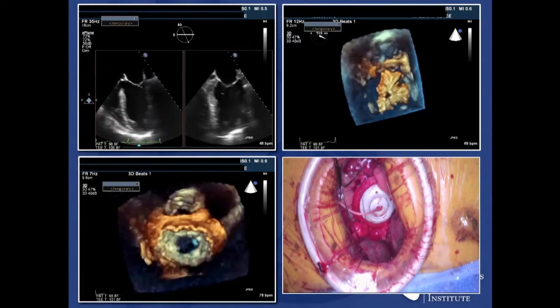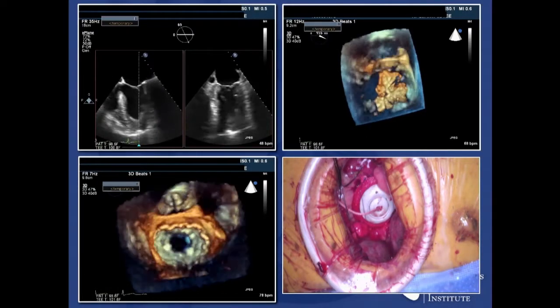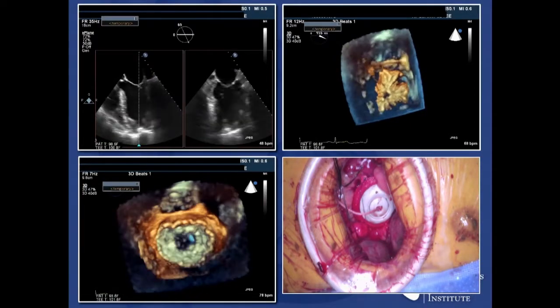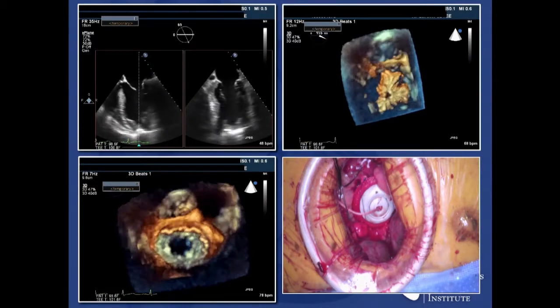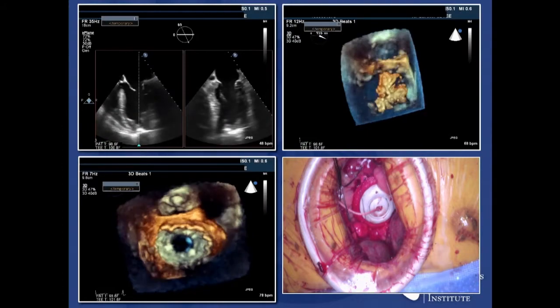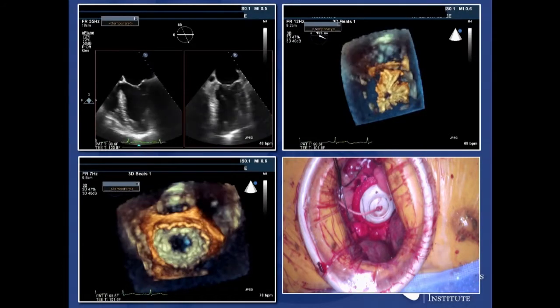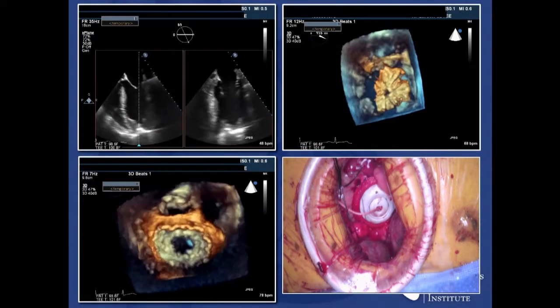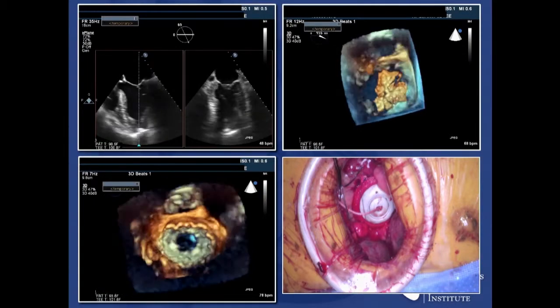You can see here in the top left-hand side, if you look at the LV apex, that radiopaque spot is actually my thumb — I'm pushing on the apex, confirming that we're down the middle both in the LVOT as well as a bi-commissural view. We then puncture, make sure we're not wrapped in the cords. And then in the top right-hand side, you can see the Tendine valve being extruded. And then the lower left-hand side, a nice 3D view showing the valve in place.